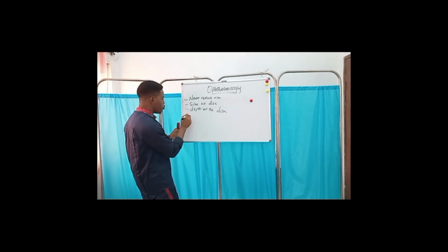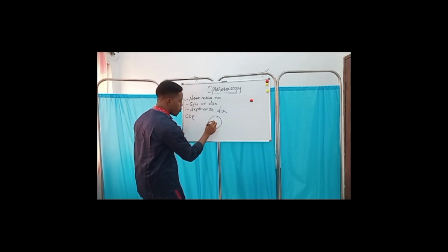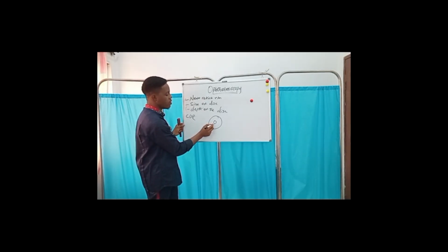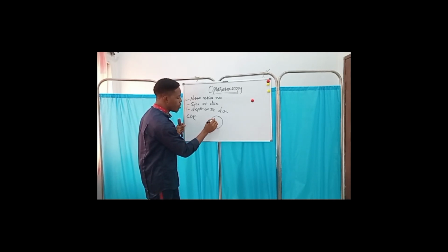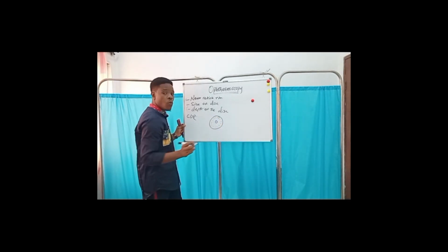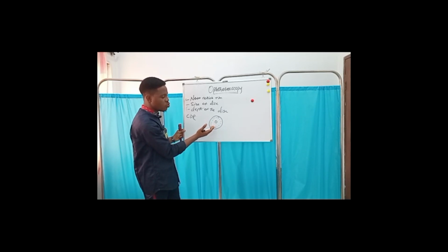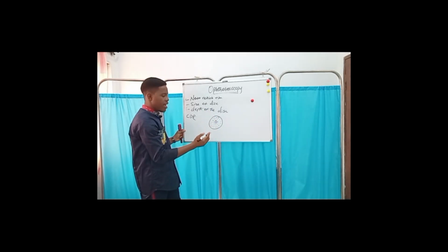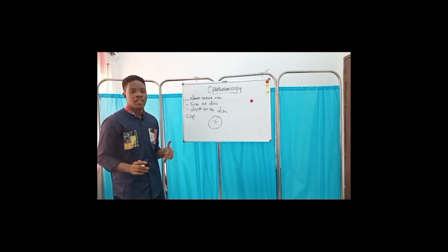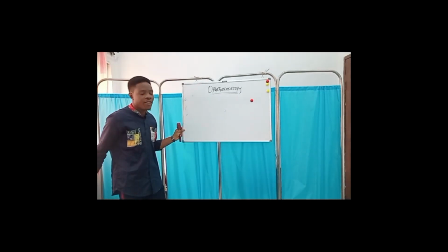And after that, we're also looking at the cup to disc ratio. Now, this is the optic disc, for instance, and this is the cup. So what we are looking at is the ratio of this to this. Because in glaucoma, the cupping is usually enlarged. So in glaucomatous cupping, instead of this, we are seeing something like this, which we don't want. So this is the ratio of the cup to disc. For this, we can estimate maybe 0.2, and somewhere here is 0.3 as the case may be, and here is 0.8, 0.9. So we want to look at the cup to disc ratio and make sure that the cup is not large. Also, at the disc, we must note the spontaneous venous pulsation.